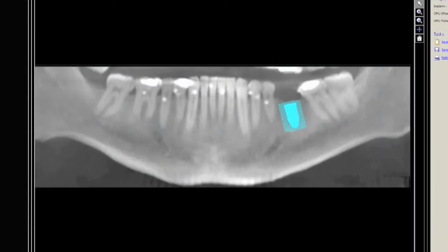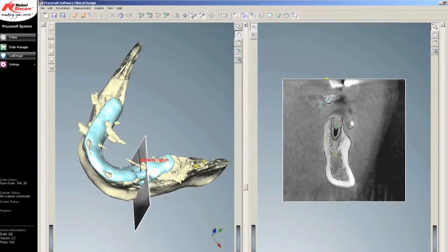The panoramic image shows adequate spacing from the adjacent roots. This final screenshot shows the trajectory of the implant through the occlusal table. Digital treatment planning allows you to ideally plan the case from both the surgical and prosthetic perspectives. Since this was a single tooth replacement, no anchor pins were planned.